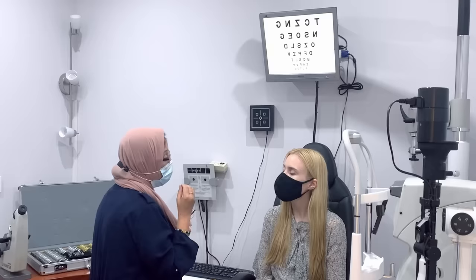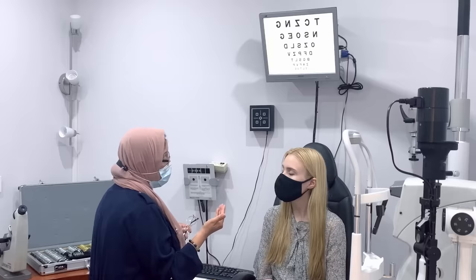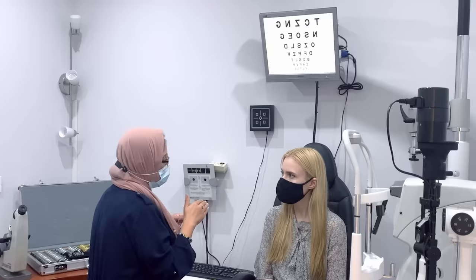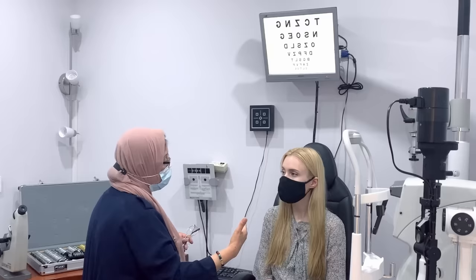So in your new glasses, I would probably suggest that we put the left astigmatism in, even though it's only a quarter, because you appreciate it. Okay. Yeah? But of course, because you've never worn it before, it might take a little bit of time to just adjust to it, okay? But at least it will give you the sharpness of vision, both in the distance and when you're looking at your computer as well, yeah?